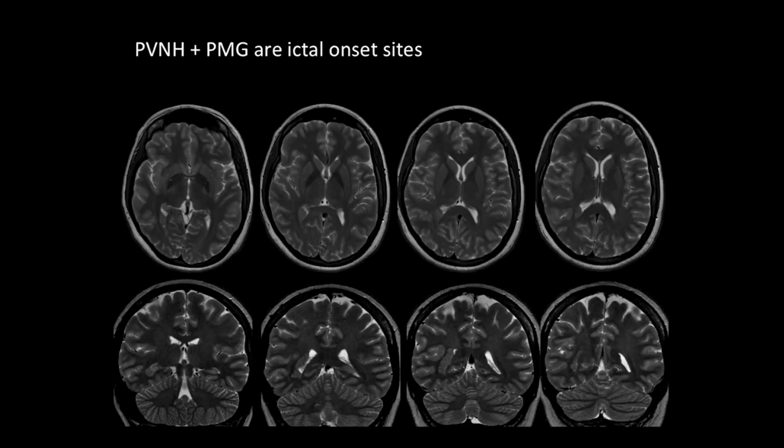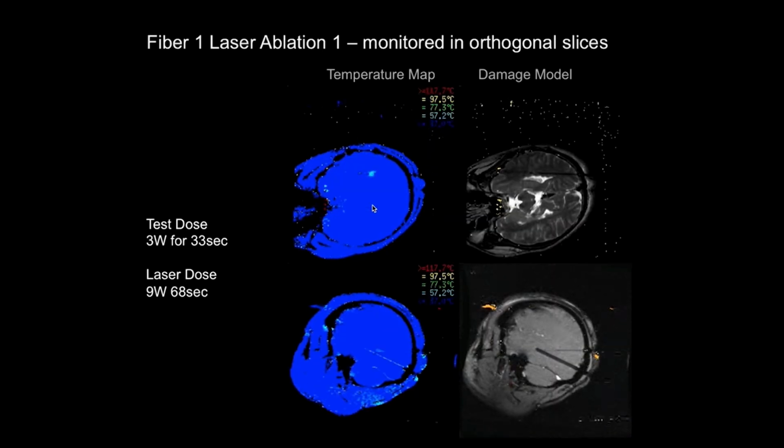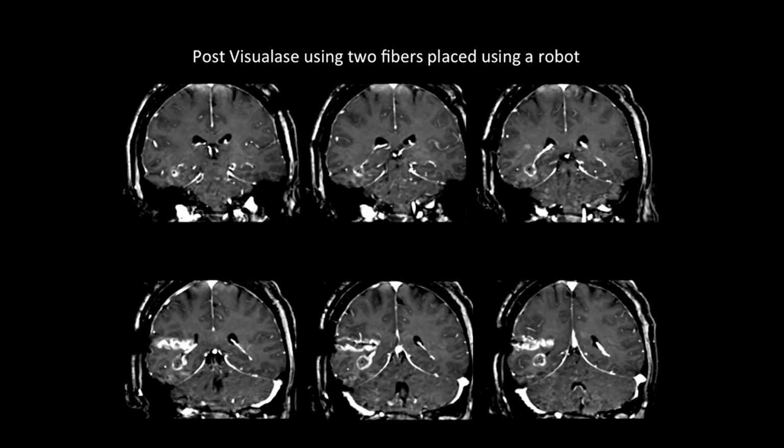So we then placed two laser applicators into this area of periventricular nodular heterotopia and through the polymicrogyria, and then did ablation of both of these regions, the periventricular nodular heterotopia as well as the polymicrogyria, using serial ablations along the length of these catheters. And here's the final damage map. So you see now there's an area of ablation of the nodule. Here is the area of ablation of the polymicrogyria.